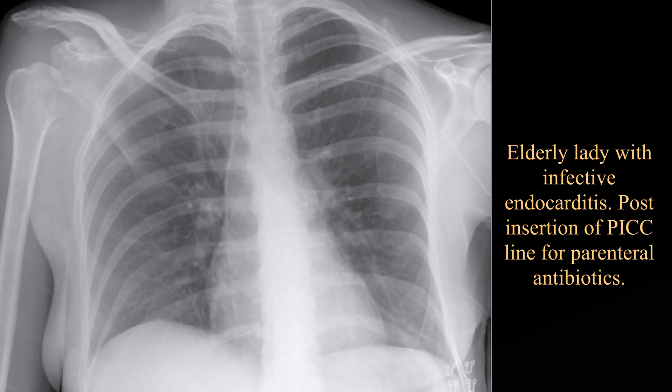There is inferior subluxation of the right humeral head. An ill-defined region of lucency is seen in the inferomedial aspect of the humeral head. There is an apparent bony fragment within the joint.